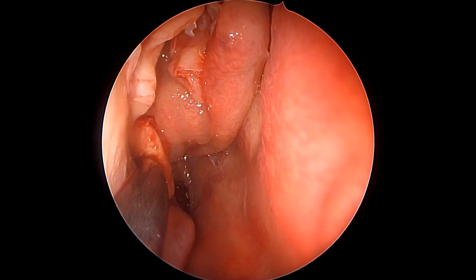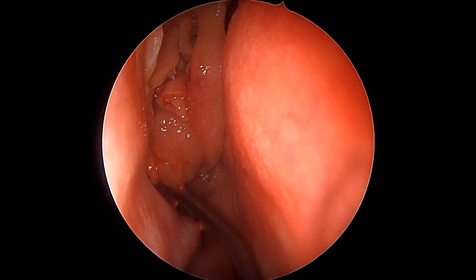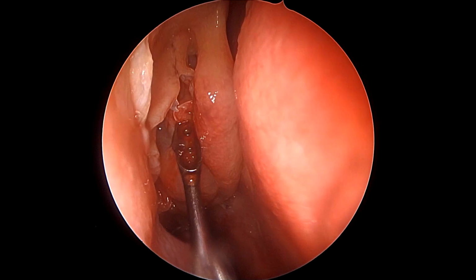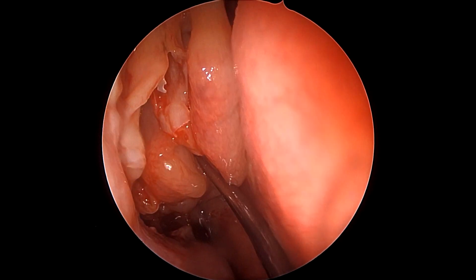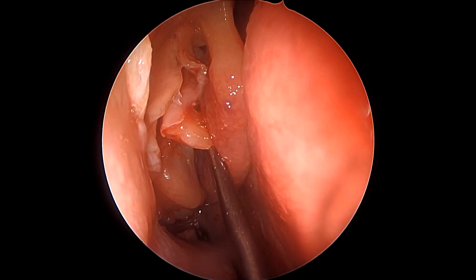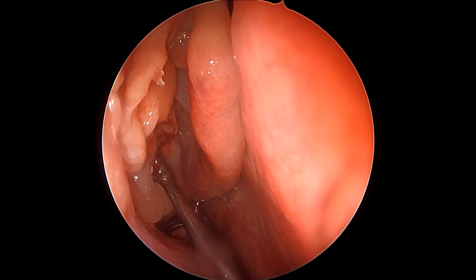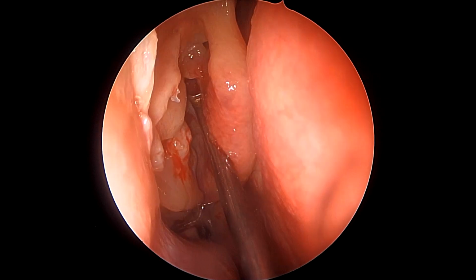Now, as we can see, we are opening the antrum, doing an antrostomy using the same frontal sinus curette, fracturing the inferior wall and the posterior wall of the maxillary antrum. And now we take our same frontal sinus curette behind the bulla ethmoidalis and again use back fracturing technique to fracture the bulla ethmoidalis right from its origin towards the skull base.